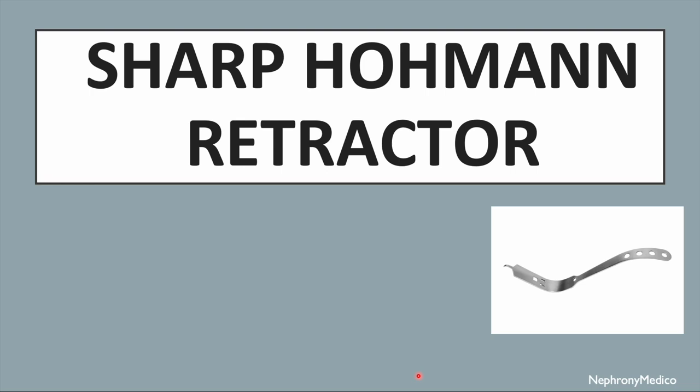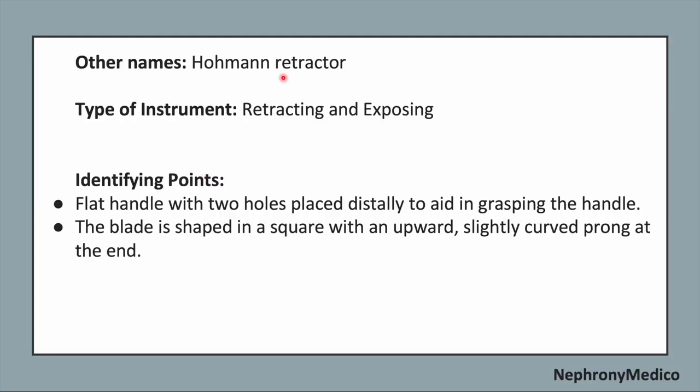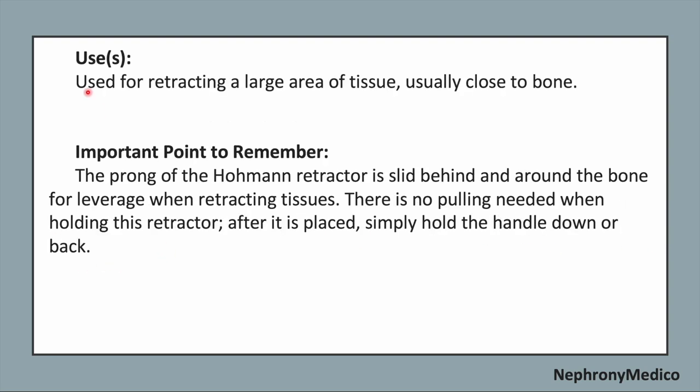Let's talk about the sharp Hohmann retractor. This is a picture showing a sharp Hohmann retractor. The other name is Hohmann retractor. It is a retracting and exposing type of instrument. Now, identifying points: the flat handle with two holes placed distally to aid in grasping the handle. The blade is sharp, shaped in a square with an upward slightly curved prong at the end. Use: it is used for retracting a large area of the tissue, usually close to bone.